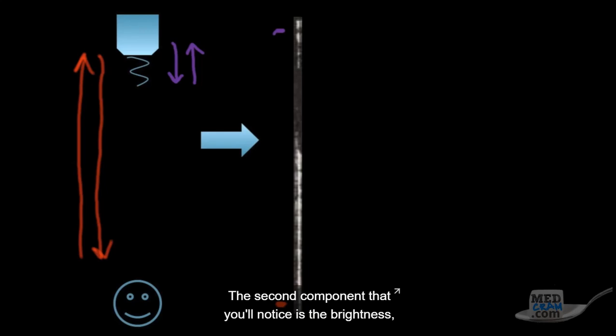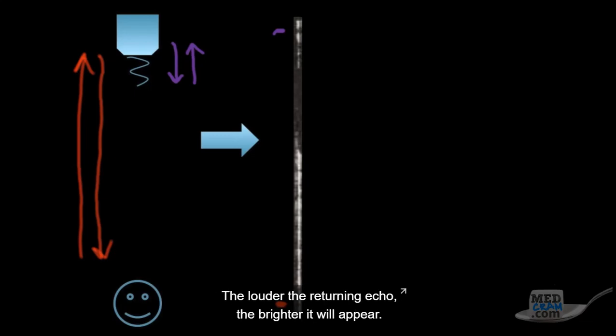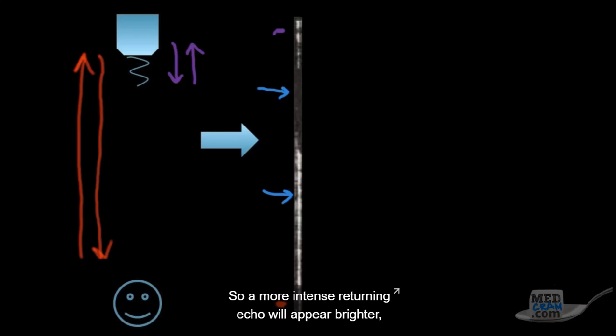The second component that you'll notice is the brightness. And think of the brightness as the volume of the returning echo, if you will, or the intensity of the returning echo. The louder the returning echo, the brighter it will appear. The quieter the returning echo, the less bright it will appear. So a more intense returning echo will appear brighter, and a less intense returning echo will appear darker.